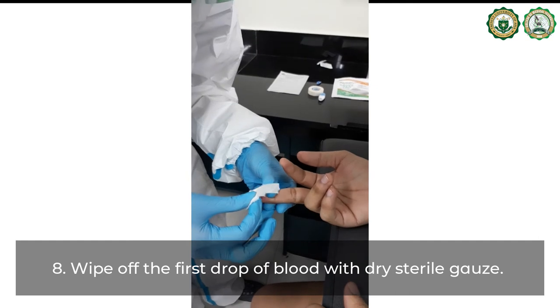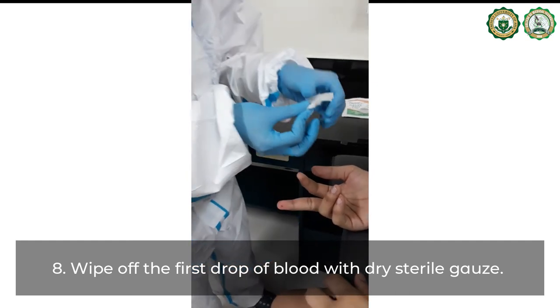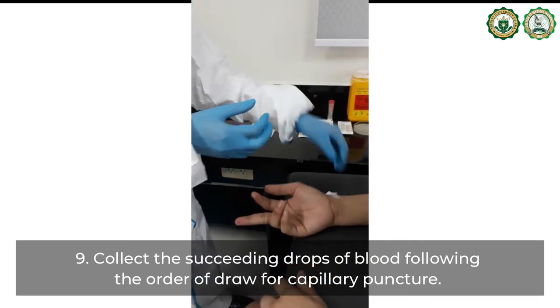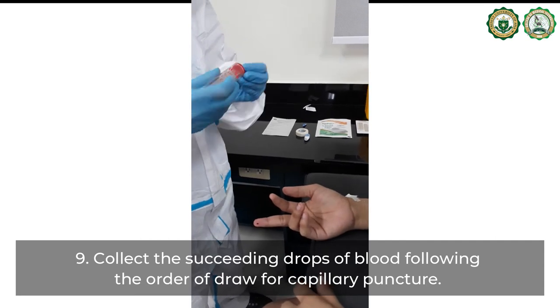Wipe off the first drop of blood with dry, sterile gauze. Collect the succeeding drops of blood following the order of draw for capillary puncture.